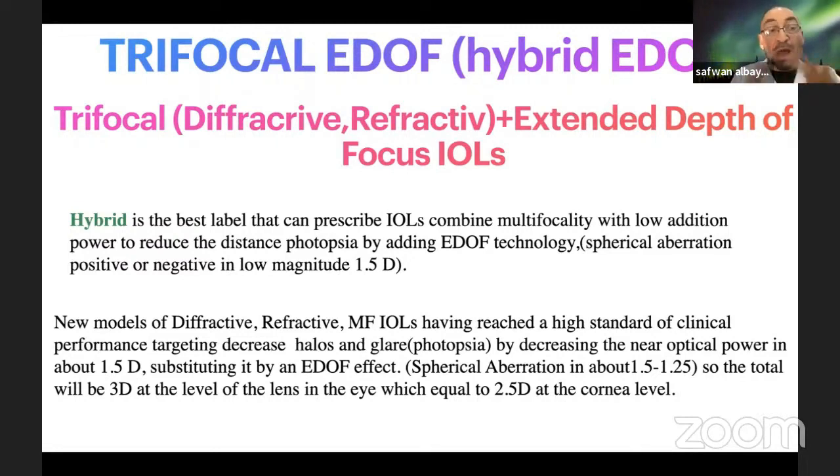Now, hybrid as a definition is the best label that can describe an IOL combining multifocality, whether diffractive or refractive, with a low addition power to reduce the distance photopsia by adding EDOF technology, spherical aberration, negative, positive, or negative in low magnitude.